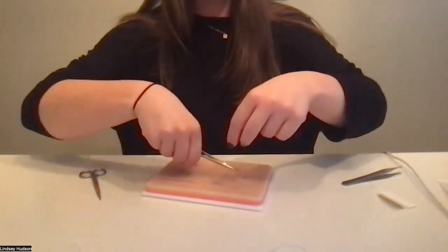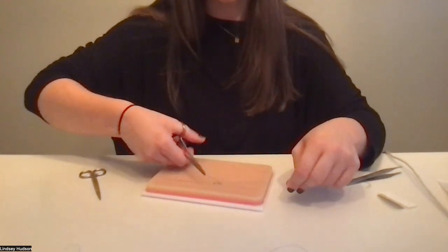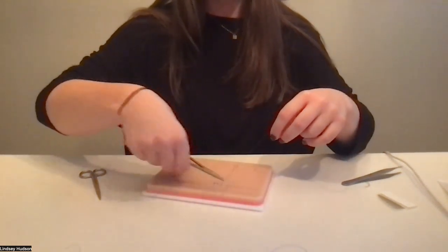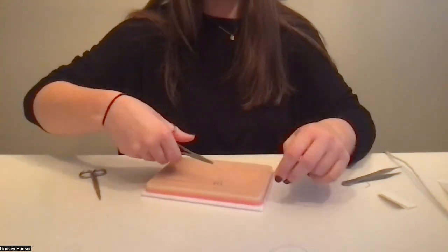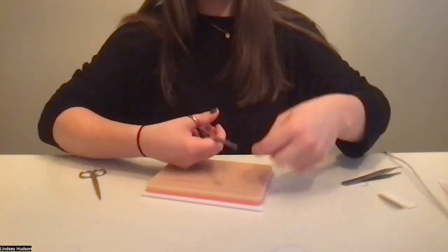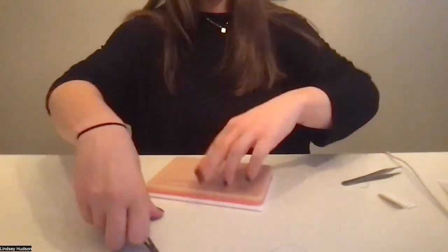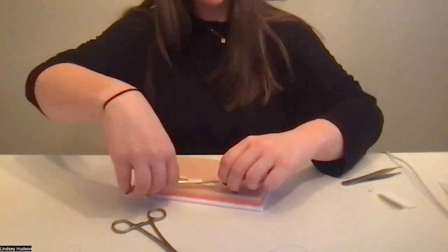And go under 1 time. Grab your tail, pull it through. Go over 1 time. Grab your tail and pull it through. And 1 more, under. Grab your tail and pull it through. Okay. I'm going to cut that excess.